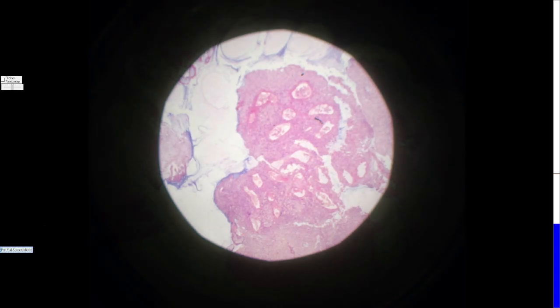So those are the histologic components of a normal POC. Now let's move on to missed abortions. Missed abortions have two main subtypes. Usually you're not able to tell them apart based on microscopic examination, but in general we can separate them into karyotypically normal and karyotypically abnormal.